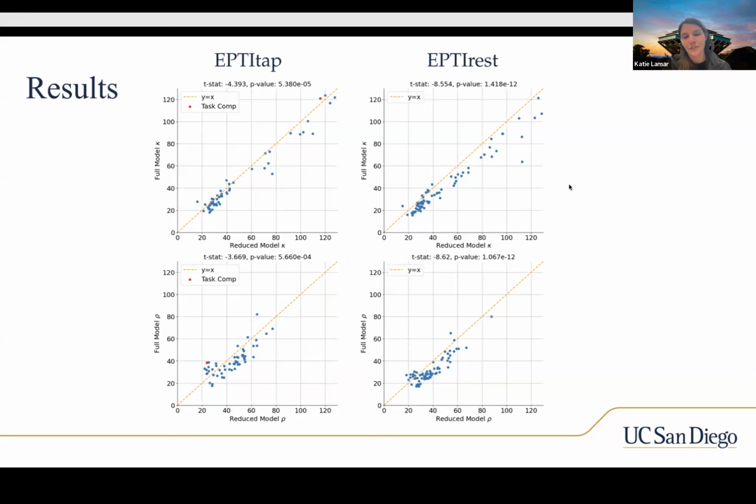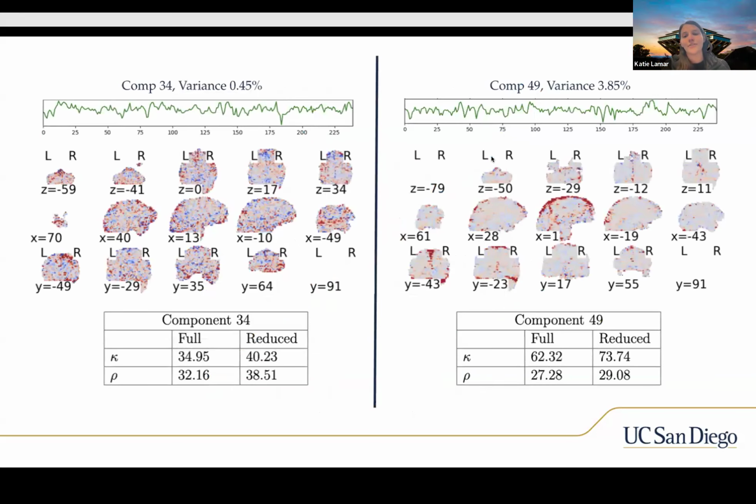And then how does this matter for the actual classification? Well, some of those noisy components that have been accepted using the reduced model are now being rejected by the full model, which is interesting to see. I didn't include it here, but it was being rejected by the second node of the original Tedana tree, which is also the second node for the minimal tree.